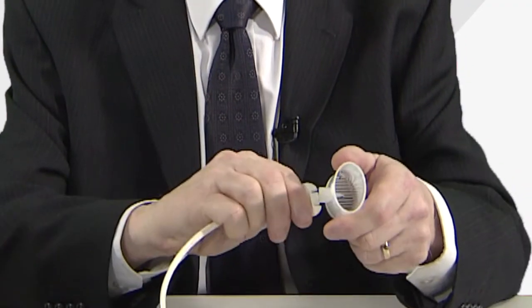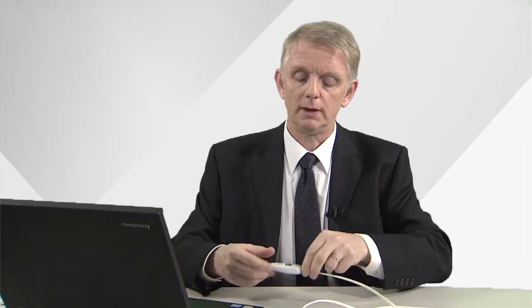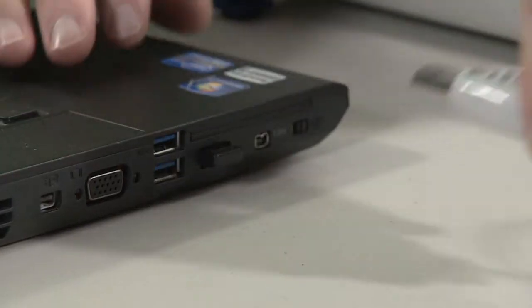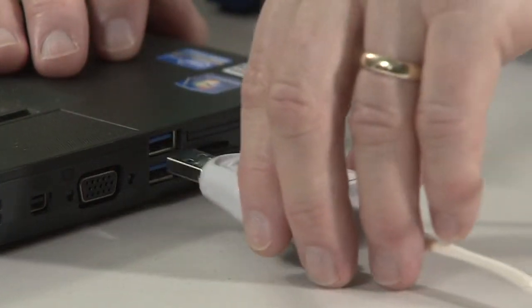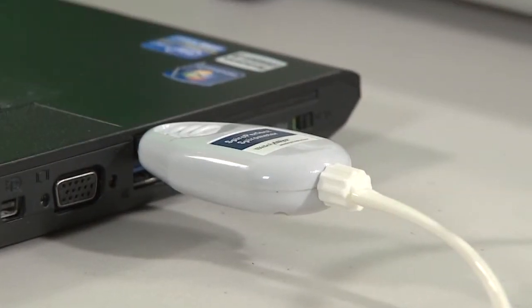You can now fit a flow sensor to the end of your tubing and connect the USB cable to your PC.